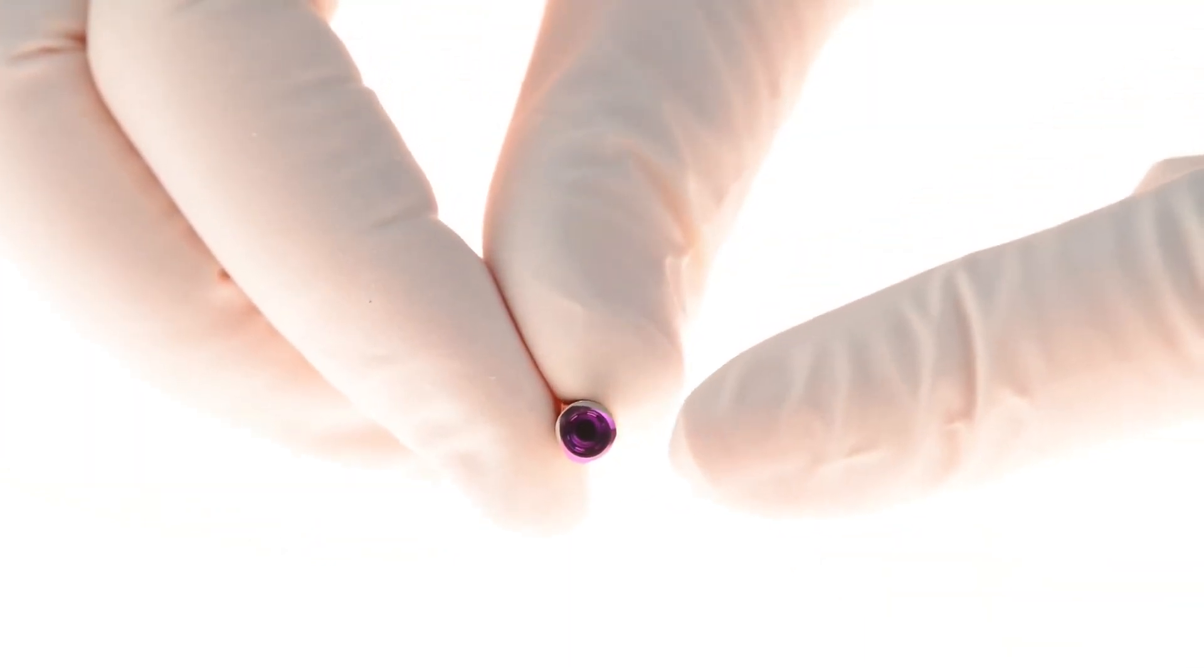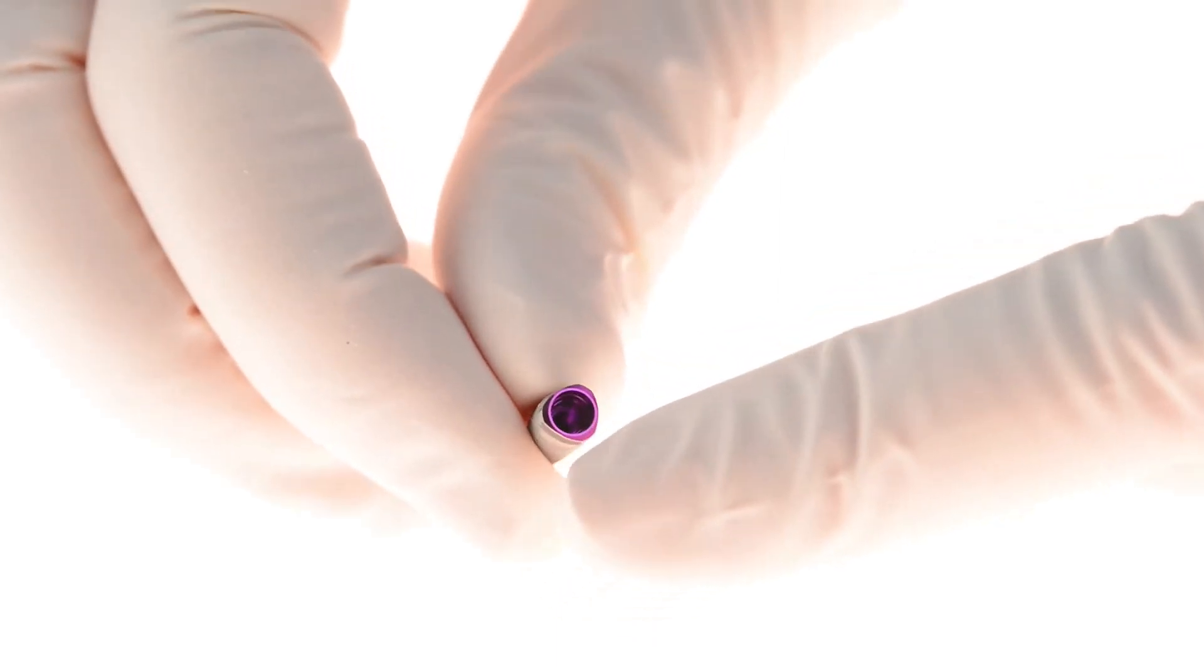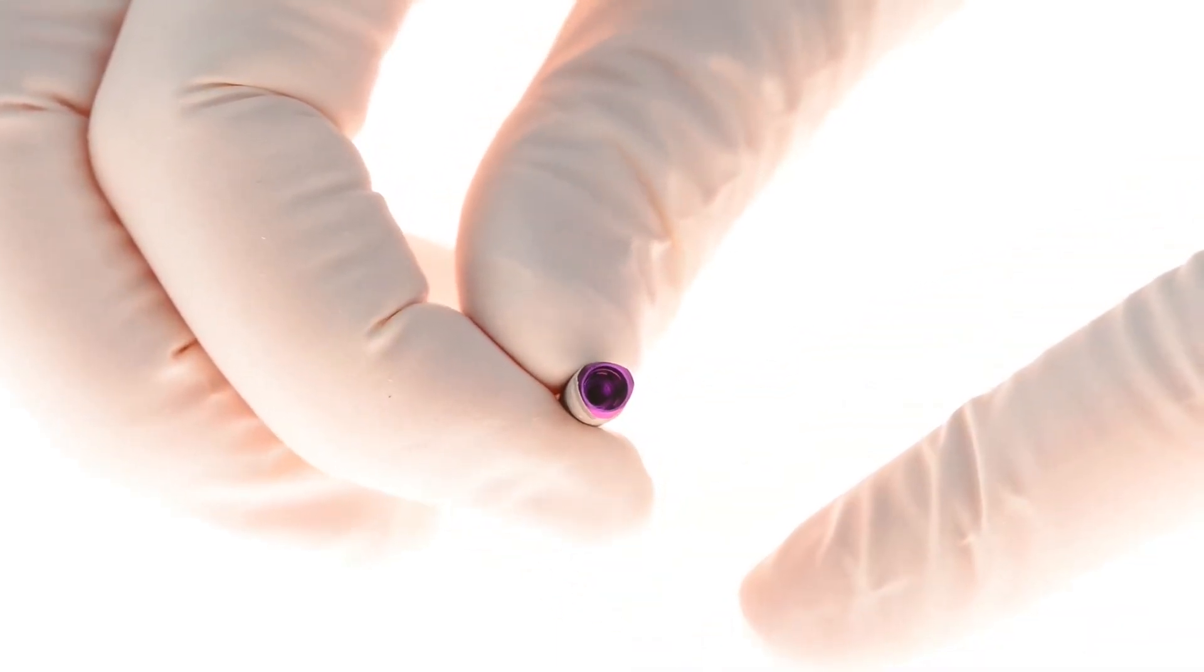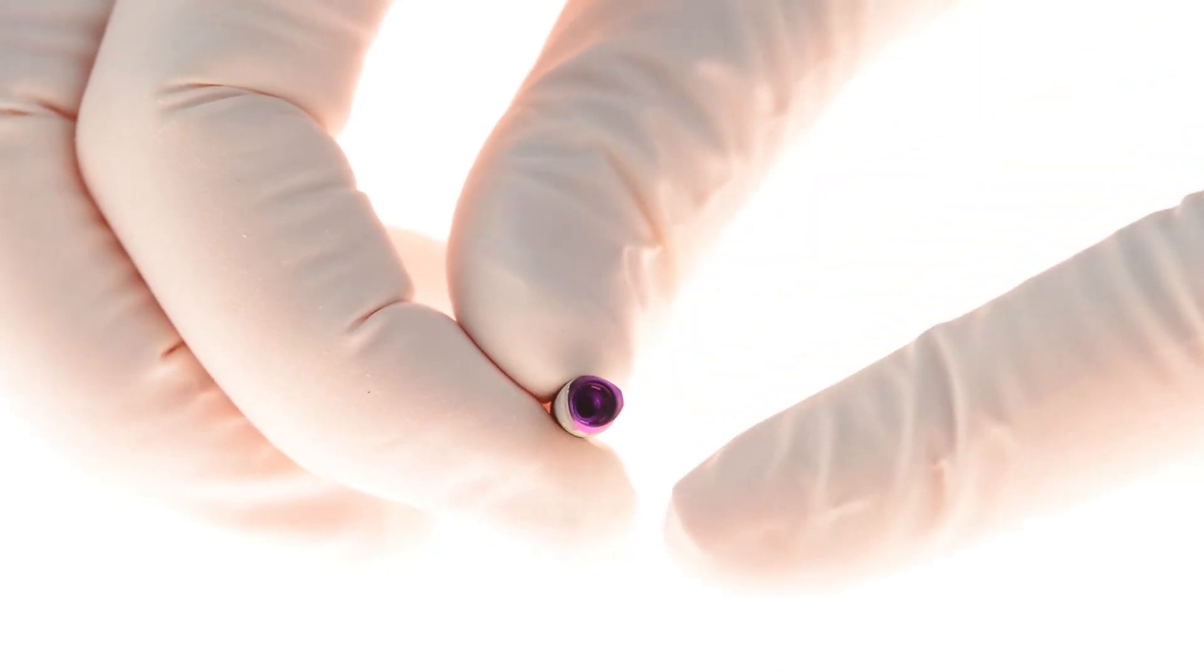The V3 has a unique triangular shape in its coronal portion, which was engineered to provide a reservoir for blood pooling and the formation of blood clots.